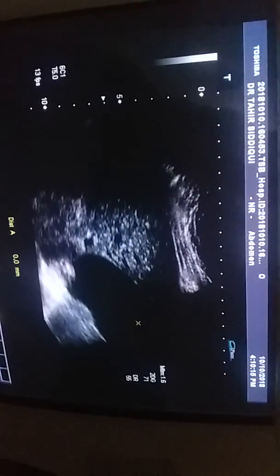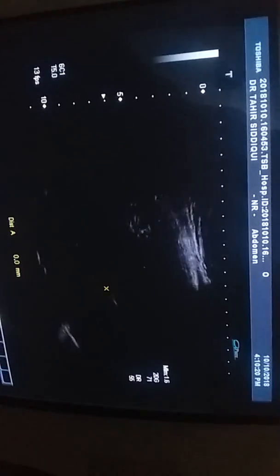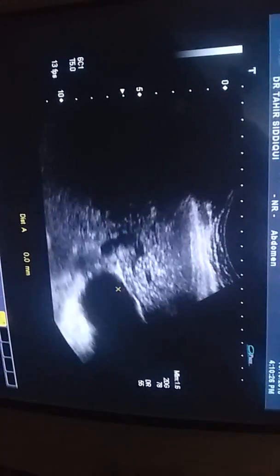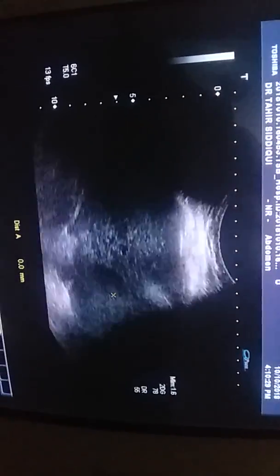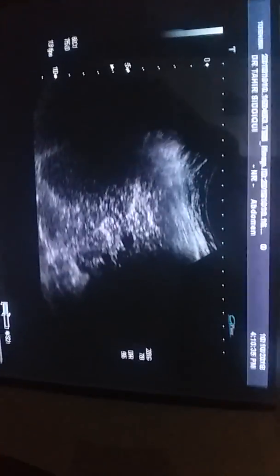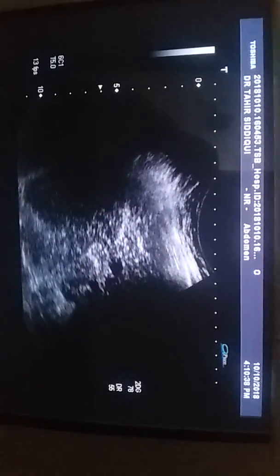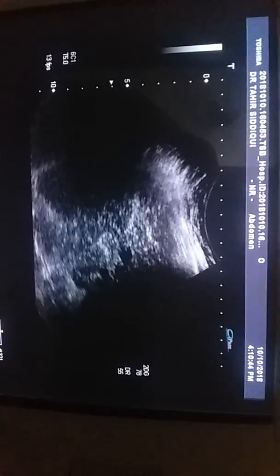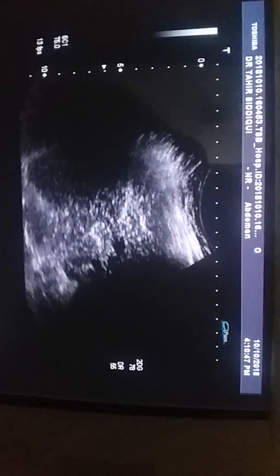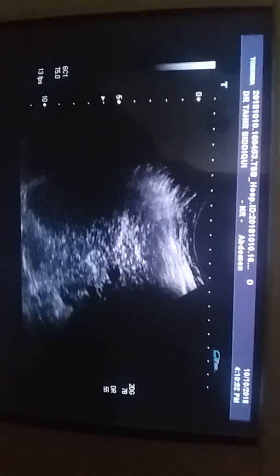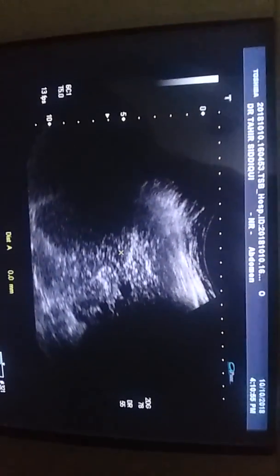This is the gallbladder. The whole of the right lobe is studded with punctate tiny calcium echogenic particles. These are a common finding in portal hypertension, in cases of cirrhosis with portal hypertension. These are due to deposition of calcium, and/or the other possibility is micro-hemorrhages.